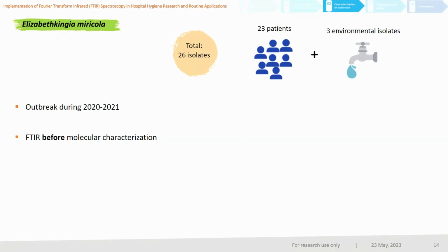In this case, the FTIR analysis was conducted before the molecular characterization and during the last months of the outbreak. So some isolates were analyzed in real time at the moment of the isolation in the laboratory. In addition to the clinical isolates, we obtained 3 more environmental isolates from the sinks in several hospital rooms.